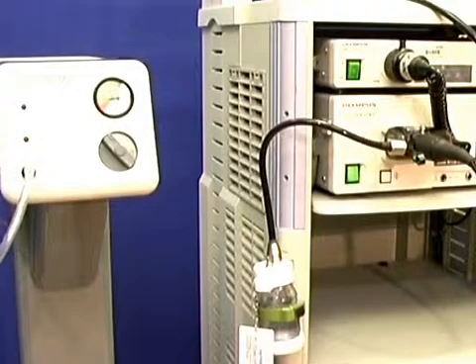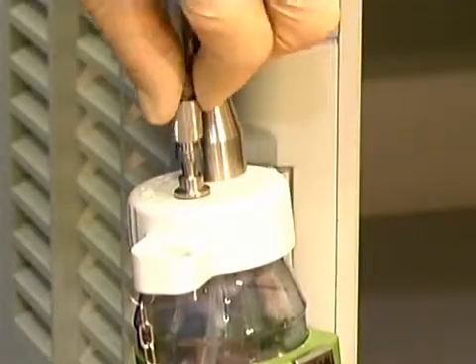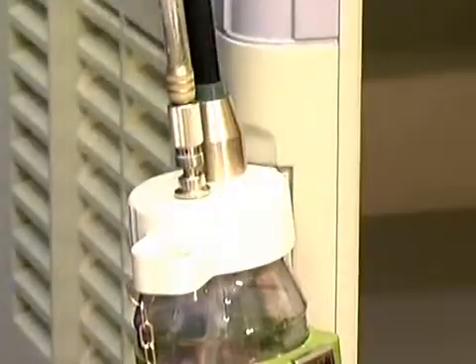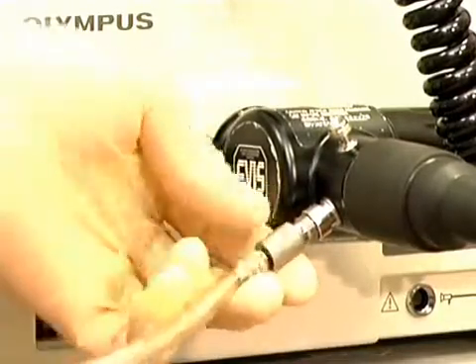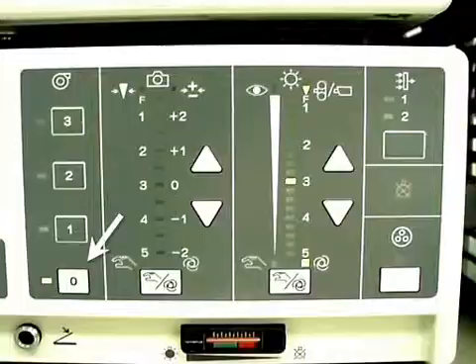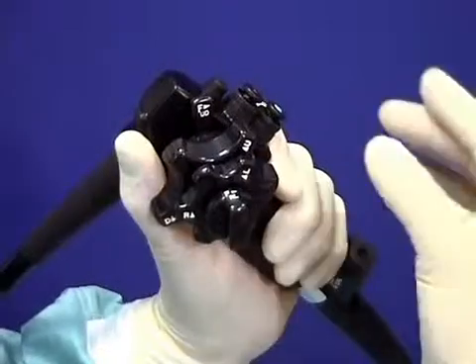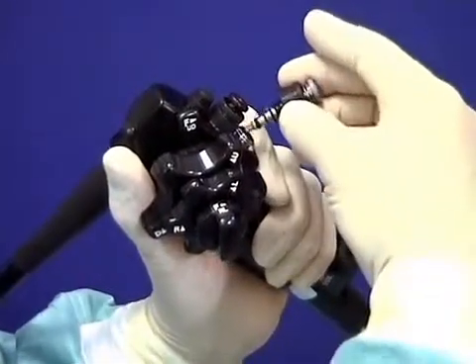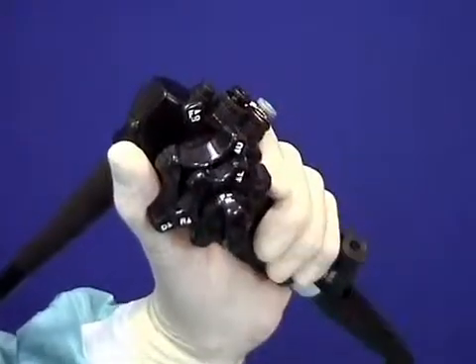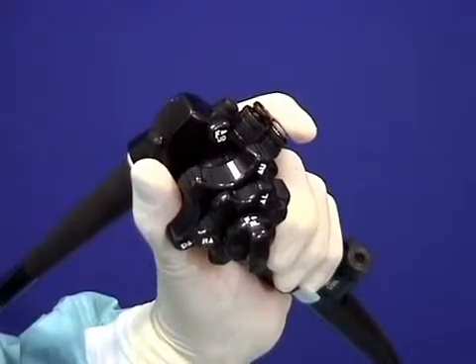The ECR is simple to use and is joined up by a tube and connector to pressurize the water bottle of newer scopes, or to the CO2 connection near the light guide plug of older instruments. The air pump on the light source is turned off, and the normal air-water valve replaced by a grey-topped CO2 valve, specially designed not to leak and waste CO2 when not in use.